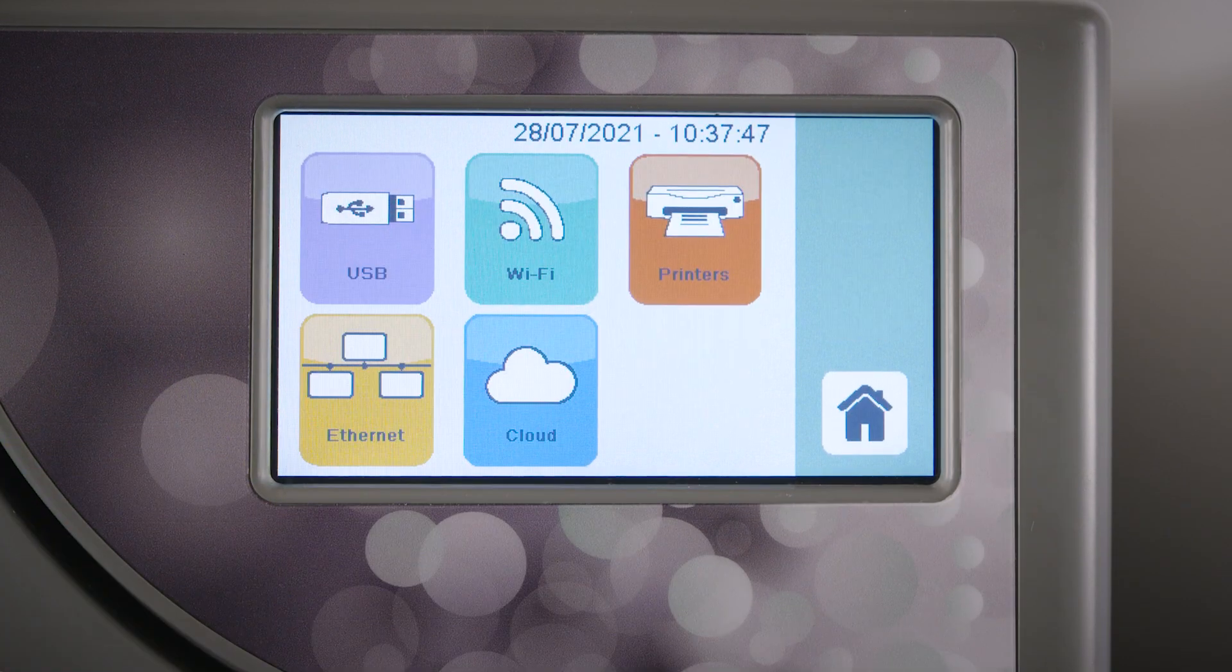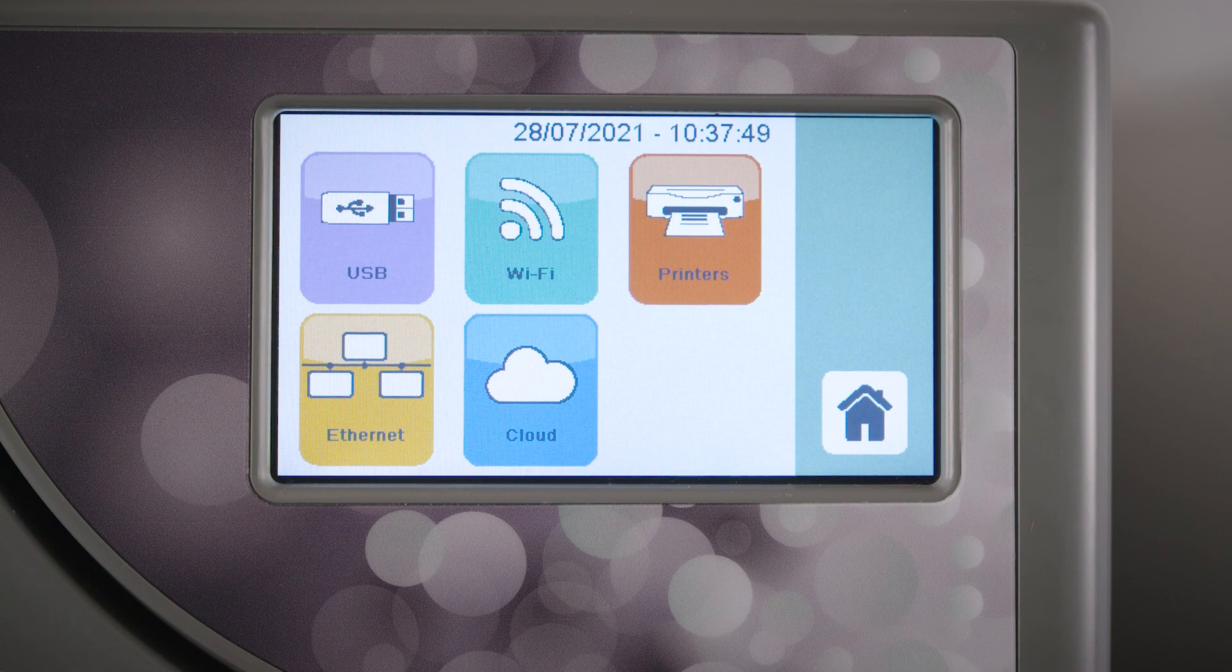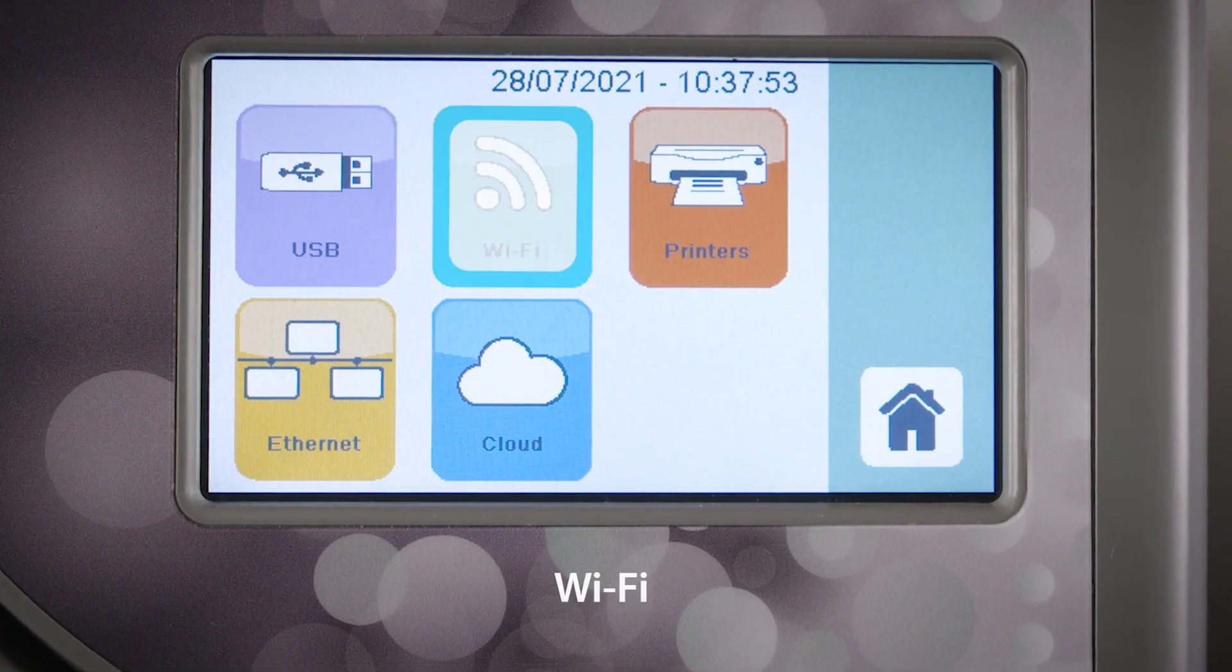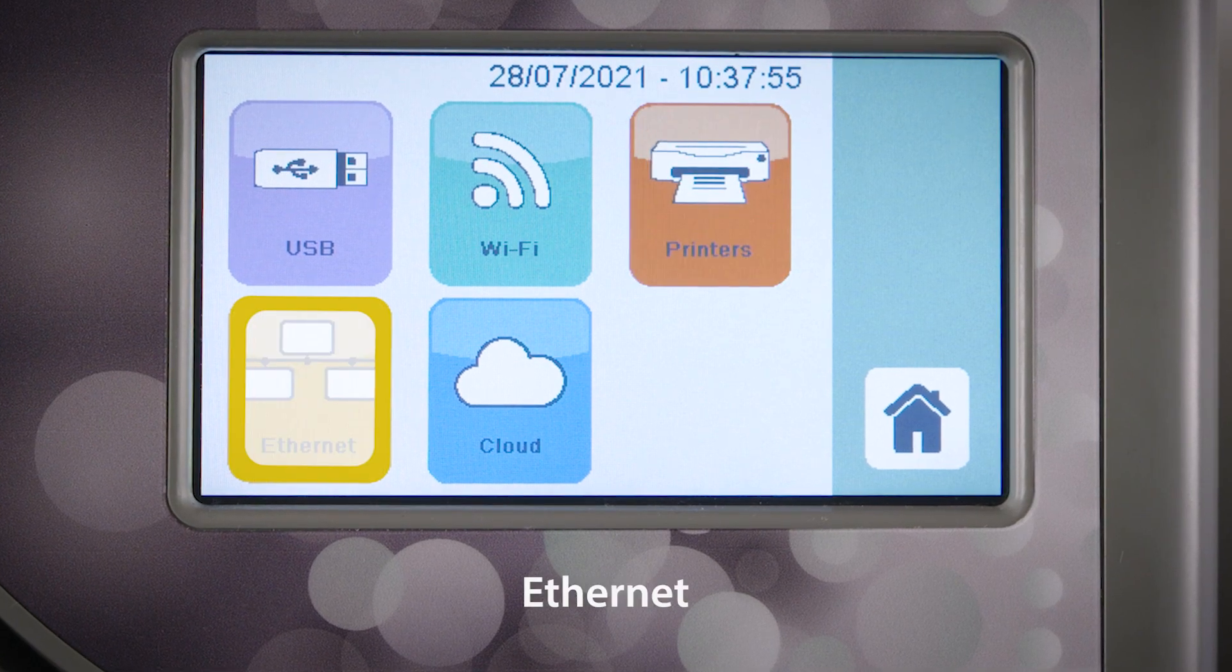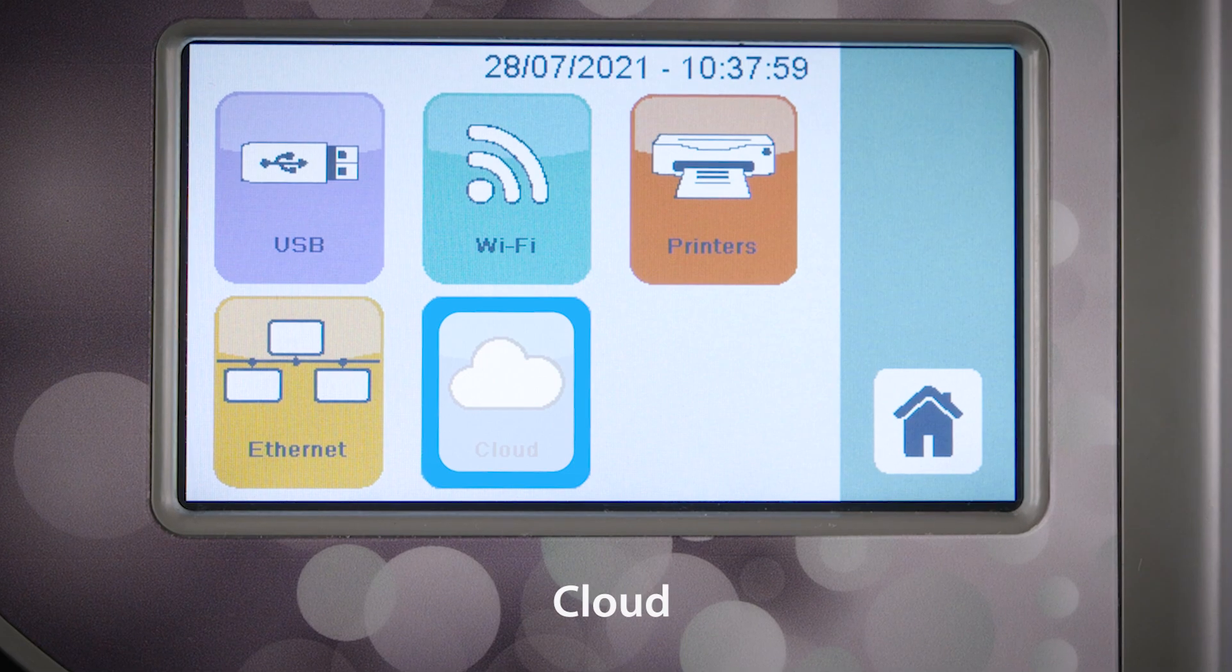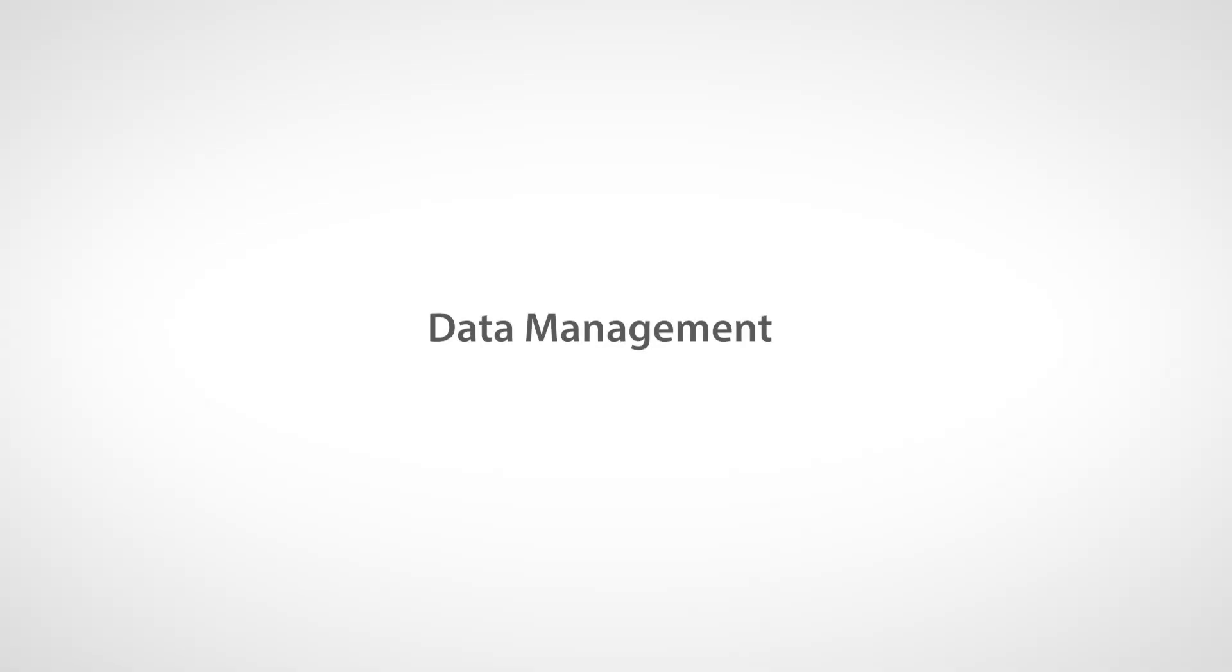Select the Data Management icon to set how you would like the unit to log cycle data, with the option of USB, Wi-Fi, Printer, Ethernet, and Cloud icons. Select the icon that best suits your data logging needs. All cycle data stored in the internal memory of the sterilizer should be transferred onto the USB.